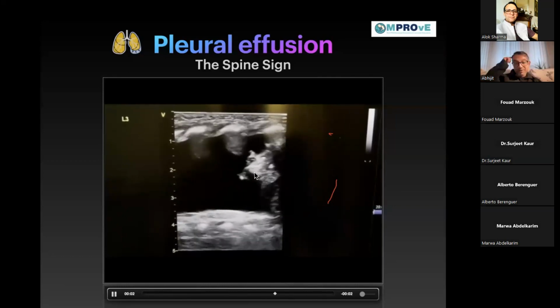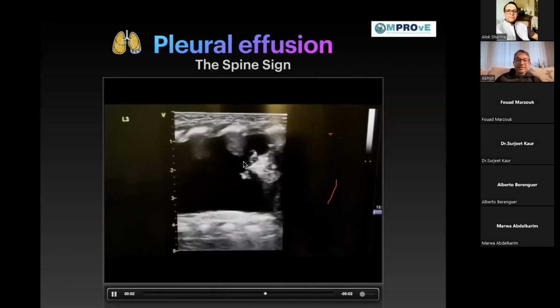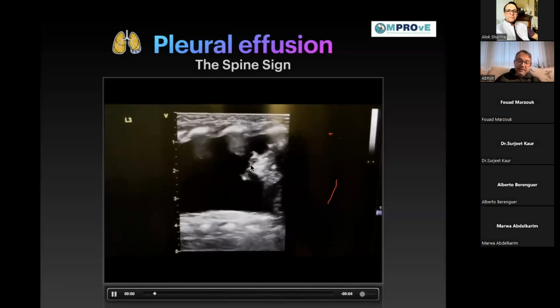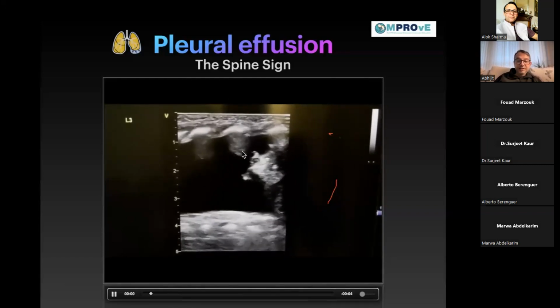I mean, without the clinical background. Anyone? No? Well, I'll just tell you. So this is a baby post-operative from the CDH, and you can imagine it was filled with the abdominal content which has been pushed back, and of course it's a voided area. There's no lung here. That's the CDH.